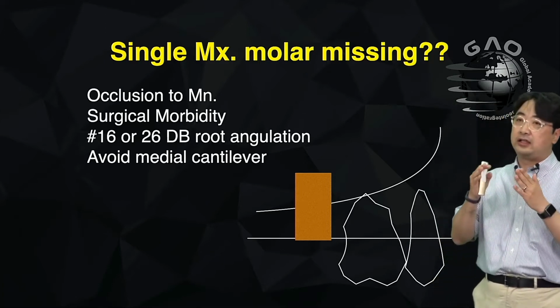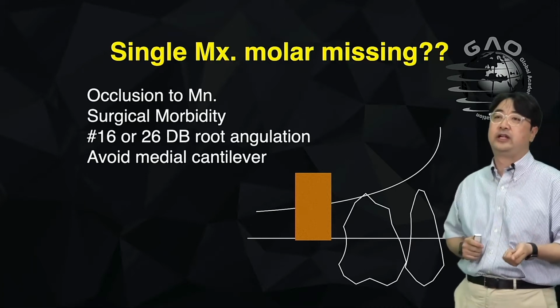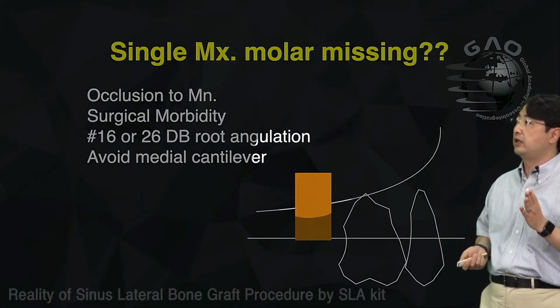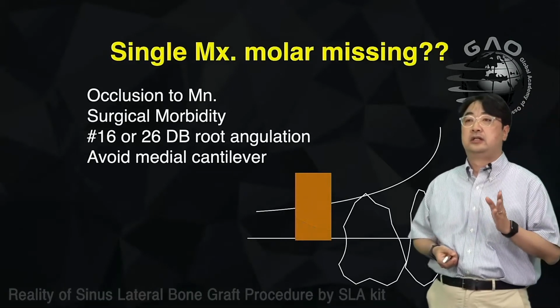But if there is only space for half a tooth, then I'll think about not doing the implant placement. So you have to check the occlusion, right? And also you have to think about the distal buccal root angulation as well.